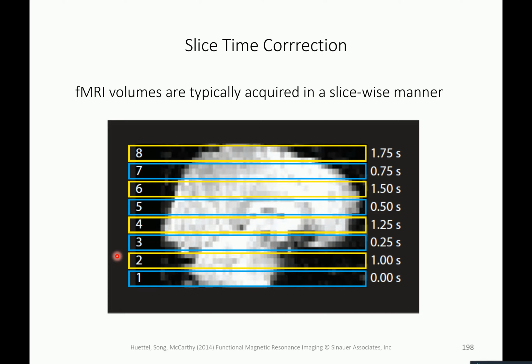A lot of acquisition schemes actually are not interleaved. So you can also just do descending and ascending slice acquisition if your focus for a given slice is actually quite good. So it depends on your signal acquisition. This difference in time for each slice is not on purpose, but because you excite different slices discretely.